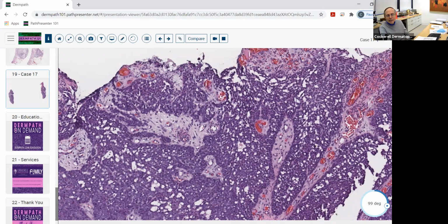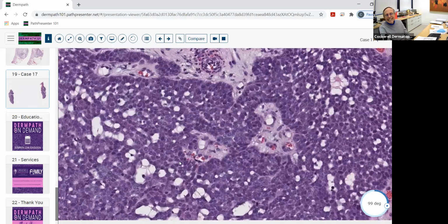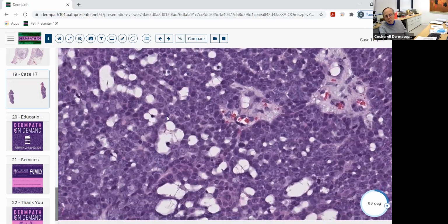So to me, really digging deeply into whether this is a porocarcinoma, whether it might be a sebaceous carcinoma in some cases, is of less importance than just recognizing that it's not just a classic garden variety benign lesion. You've got asymmetry, you've got mitotic figures, you've got areas of necrosis, you've got ulceration.